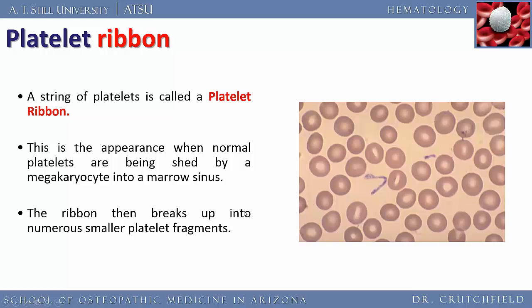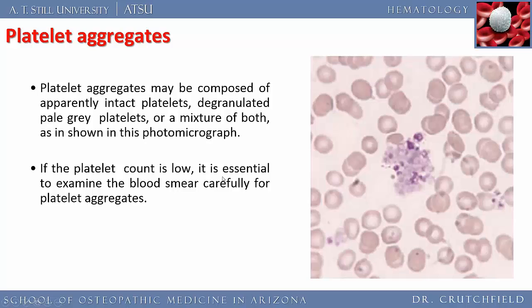And the ribbon will then eventually break up into numerous smaller platelets. Probably not really clinically significant, other than if you see these, they're just a little precursor to the normal platelets getting ready to break up.